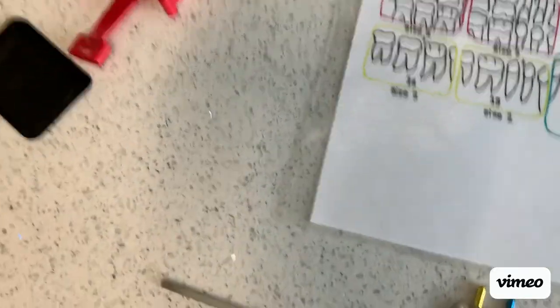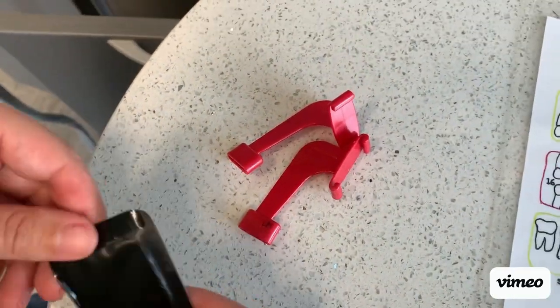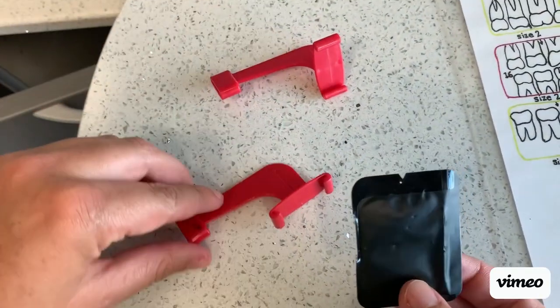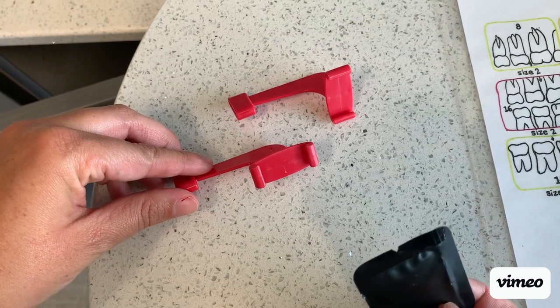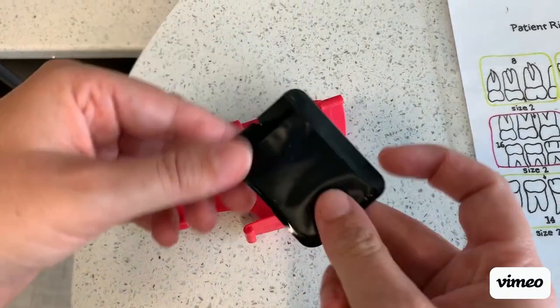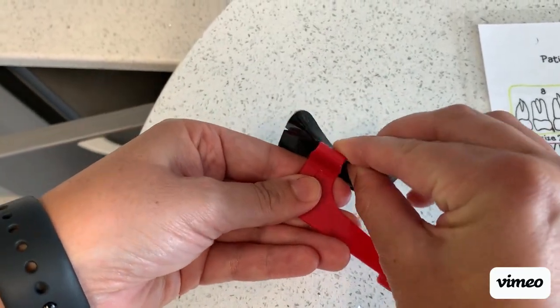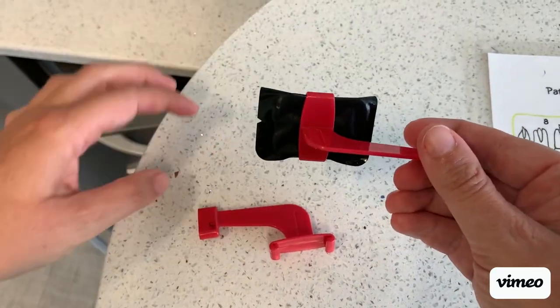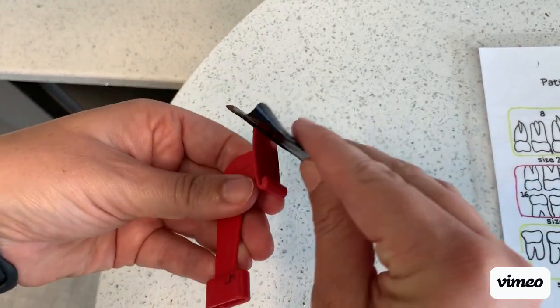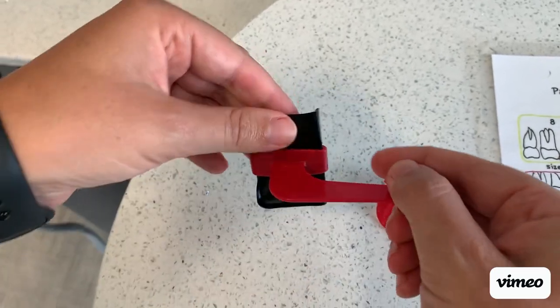To show you how to set up the XCP, we are going to start with plates. You're going to use a size two plate for your bite wings, and you're going to have two options for XCP holders. If you put the plate into this holder, it's going to run horizontally. And if you put the plate into this holder, it is going to run vertically — that's the only way it fits.